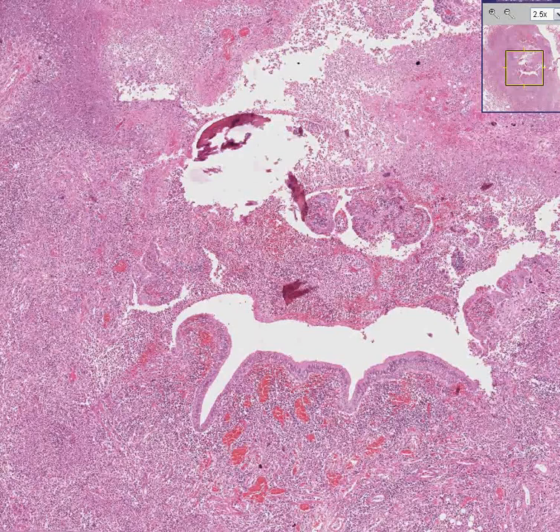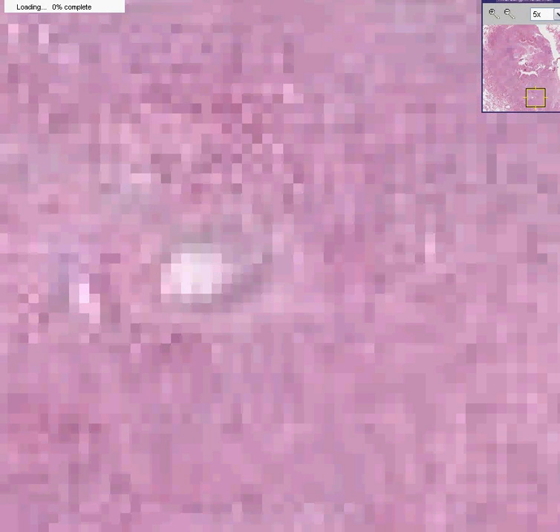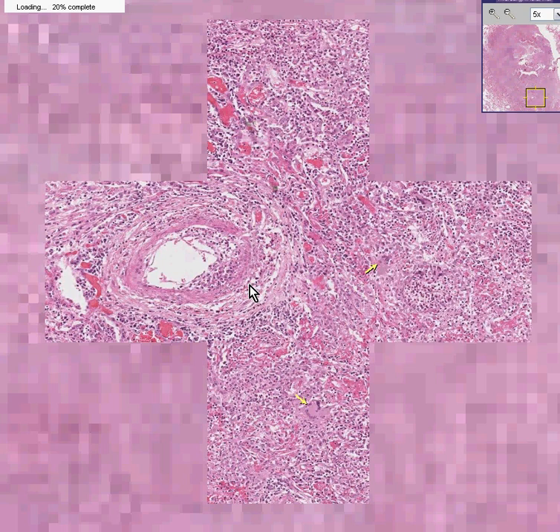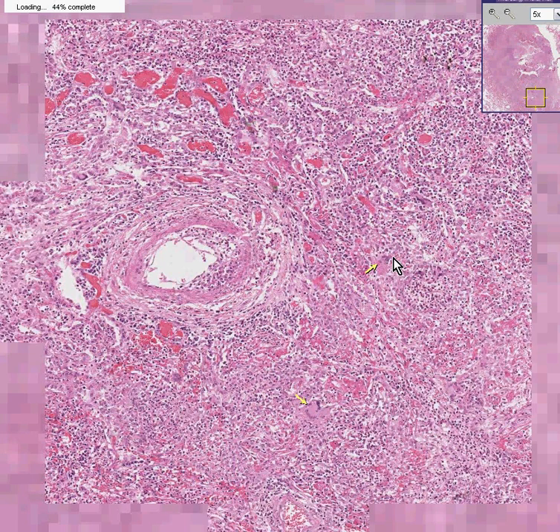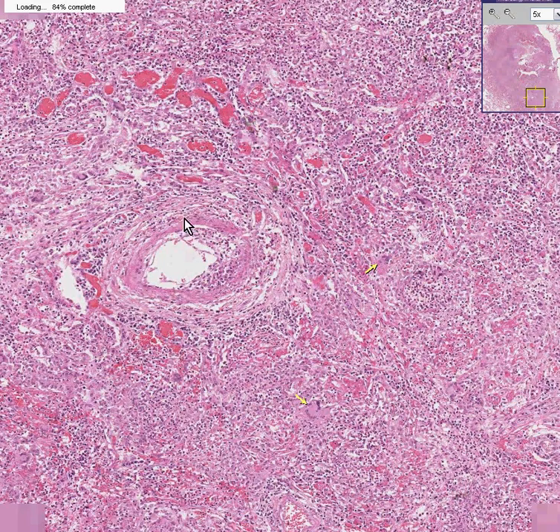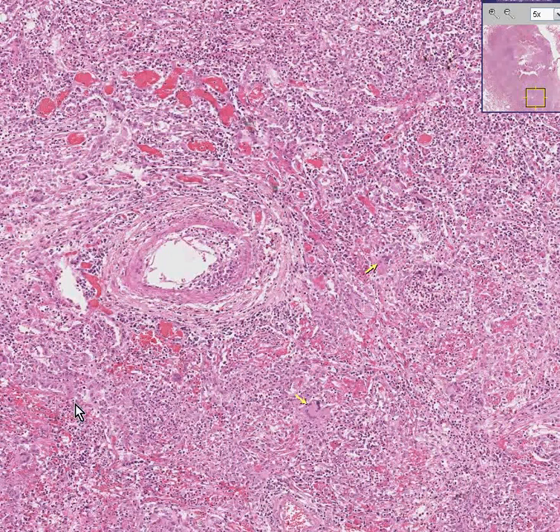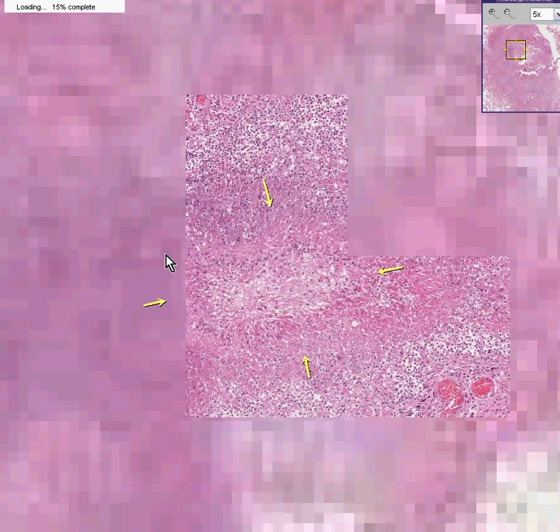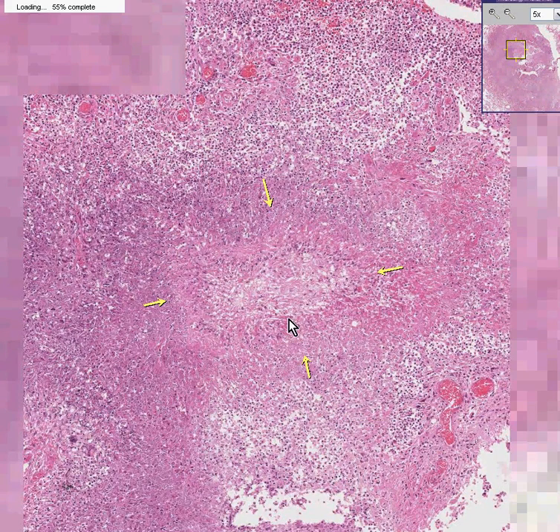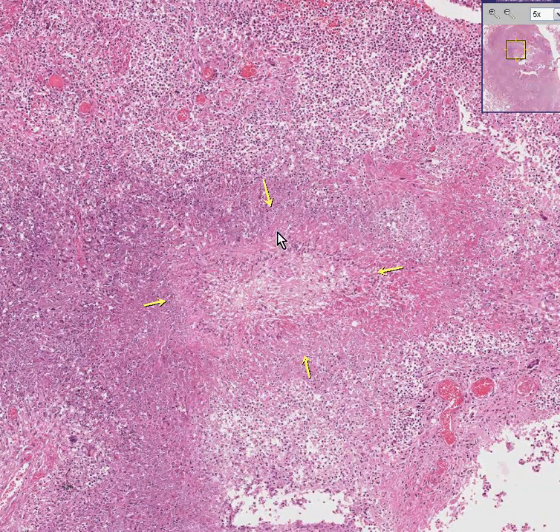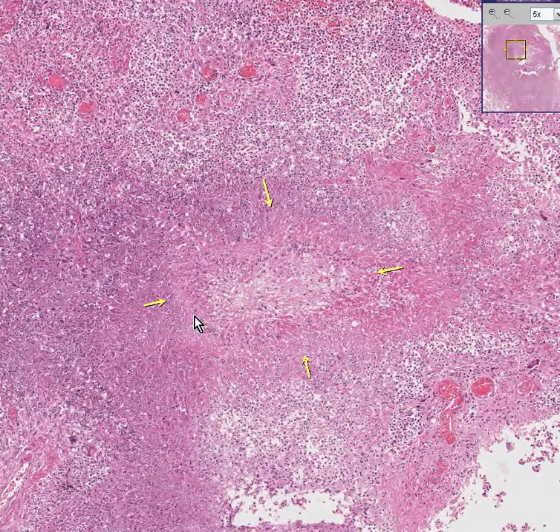Two other features I would like to show you that are part of Wegener's granulomatosis — besides the fact that they have these nice multinucleated giant cells — is the fact that you have a vasculitis. Here's a medium-sized blood vessel, and it is inflamed throughout its entirety. Not only is it a vasculitis, but the blood vessels often become necrotic as well, so it is a necrotizing vasculitis. You can barely recognize the blood vessel because the wall appears to be almost completely necrotic, as in a fibrinoid type of necrosis.